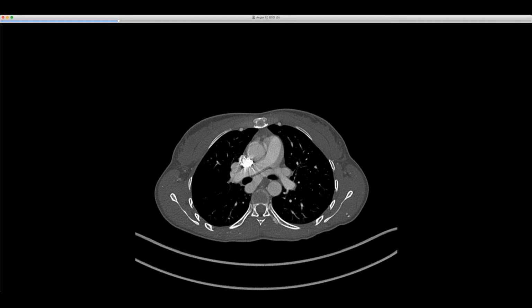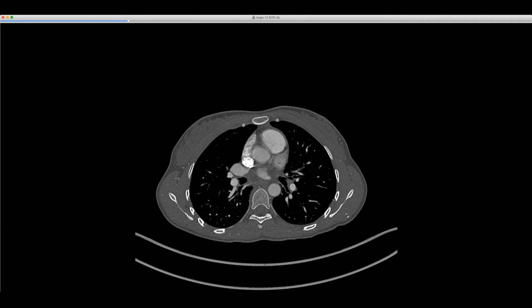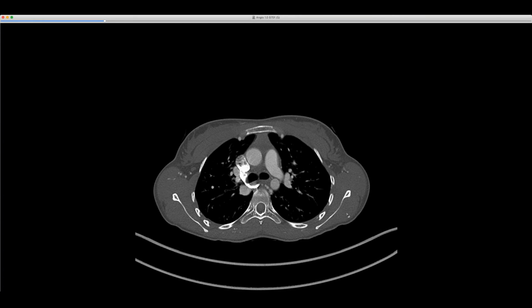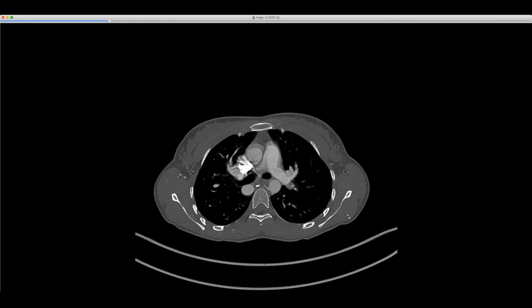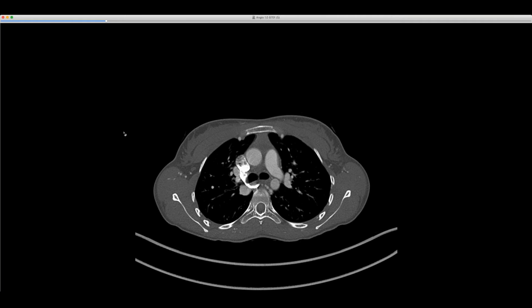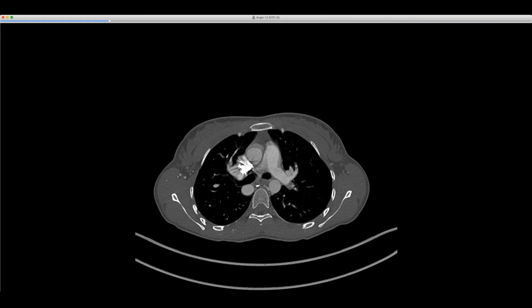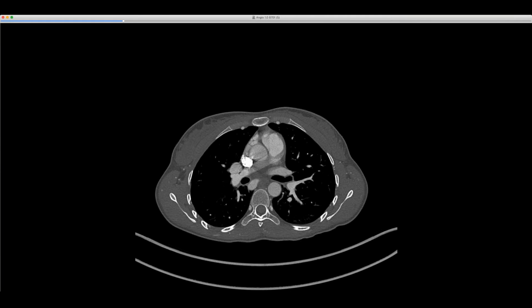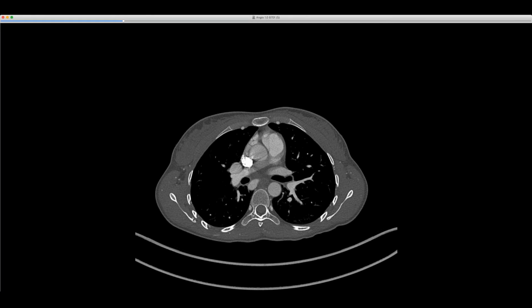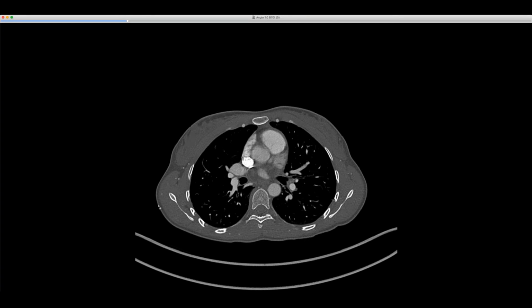No, but that was the original description, wasn't it? The one that was right-sided, crossed midline, crossed the mediastinum and then drained into the... I don't think so. We should look that up. I don't think that was his original description. I was under the impression that the ones I've seen that I've called meandering don't cross midline. They just take this weird, crazy course on one side. But it may be true that I just haven't seen one cross before. That may be the original description. I just need to look that up too.